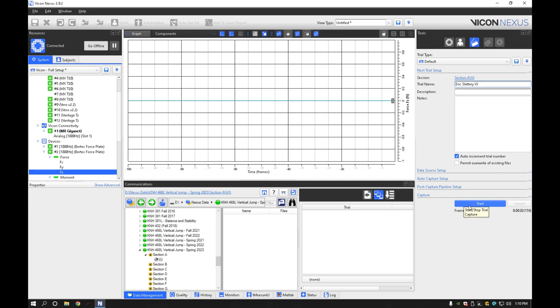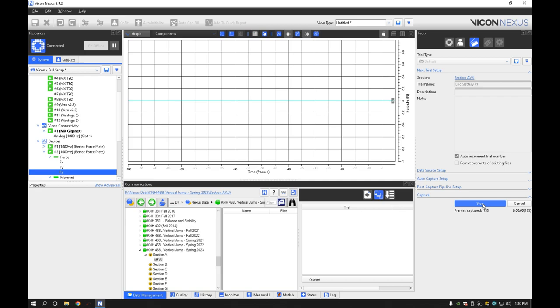Alright, so at this point, you will want them to step on after we've zeroed and everything and we're ready to go. You'll have them step on and stay as still as possible. And then after being still for a few seconds, tell them when you're ready, go ahead and jump. Because again, we need that stillness before we have them go ahead and jump. So I'm going to go ahead and demonstrate this.